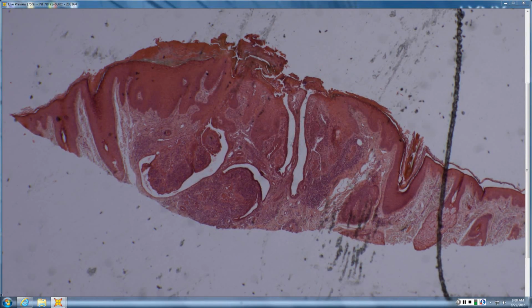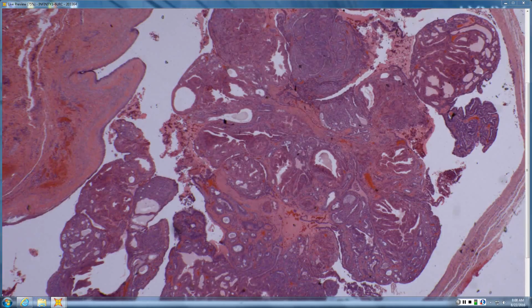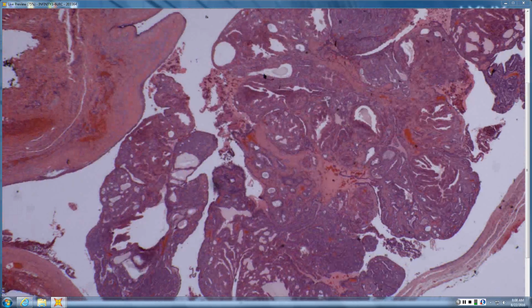So what is it? Syringocystadenoma papilliferum. An SPAP. Exactly, because the SPAP you can slide into, whereas the HPAP you hide in. So this is an HPAP, which doesn't connect to the surface. But if you have something that looks like an HPAP on a digit, take a good look, because it's probably malignant, and those metastasize and are bad actors. So something that is HPAP-ish, but on an acral site, be careful.